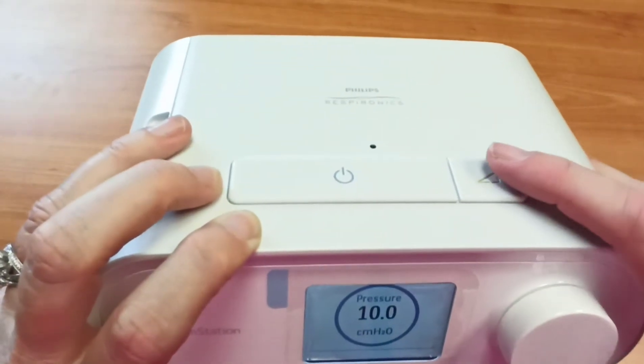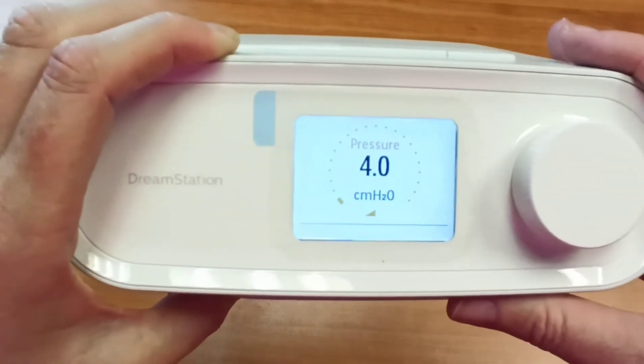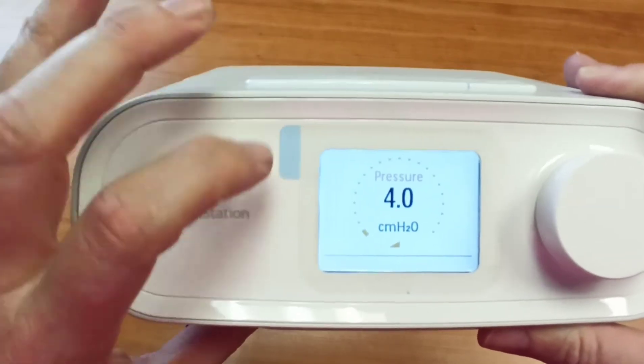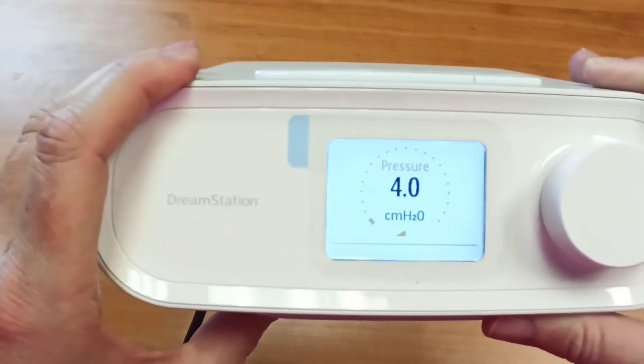It will climb back up by itself. So you just hit this button here, your ramp button. The ramp icon pops up on the screen and your pressure drops usually to four — that's the default setting. It takes 20 minutes to climb back up, which will be indicated in this circle here. And it will creep up all by itself. You don't have to do anything.